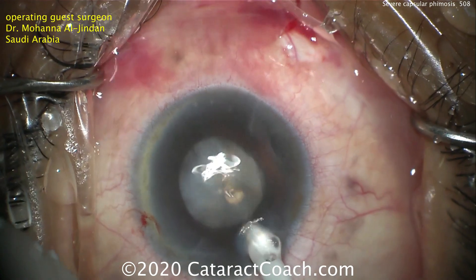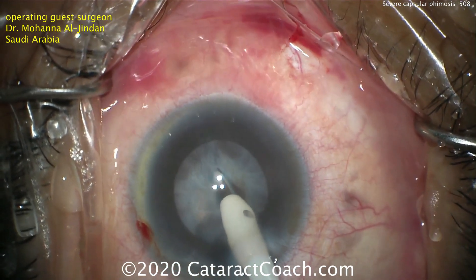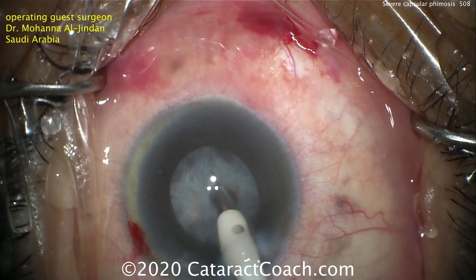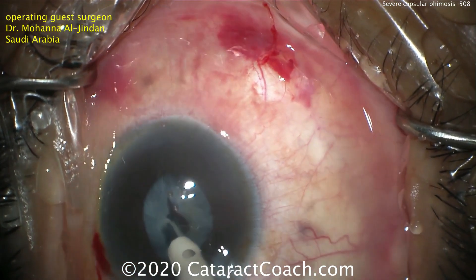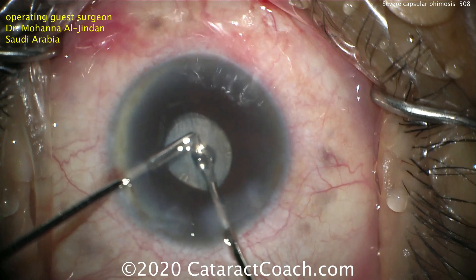So that initial cut — a few things are going to be tried. First is using a phacoprobe: can the phacoprobe be used to buzz into and maybe break apart some of this anterior capsular structure? The answer in this case is not really. This is such a thick and fibrotic tissue now with so much contraction that even the phacoprobe won't buzz into it.